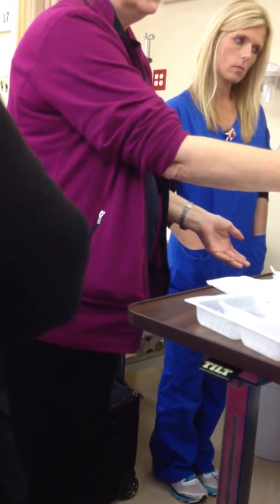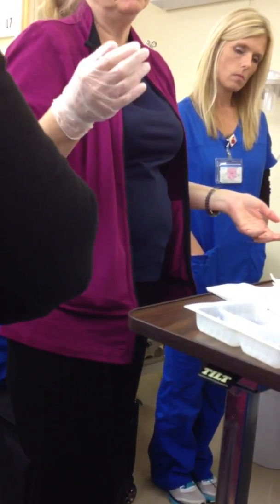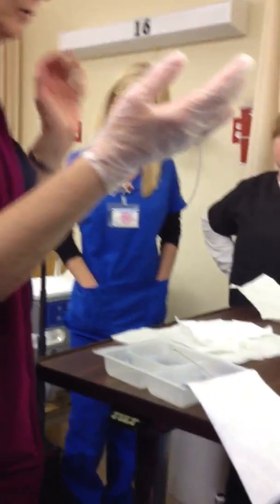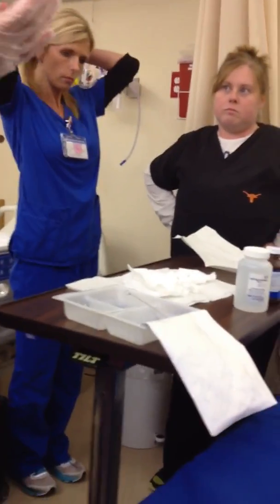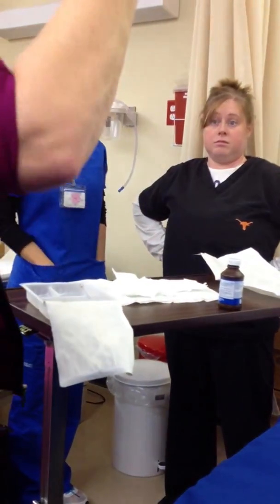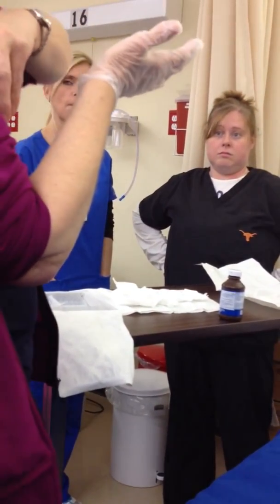And then I don't want to cross over my sterile field because that breaks one of our sterile technique rules too, right? So what I'm going to do now, because of my unsterile hand here, I'm going to come around this way and take the lid off. Can we take the lid off before we say this? Well, you can, but you just don't want to. Now, if you get stuck and you can't get it off, there's a trick. Use your underarm. Those pits come in handy for something.